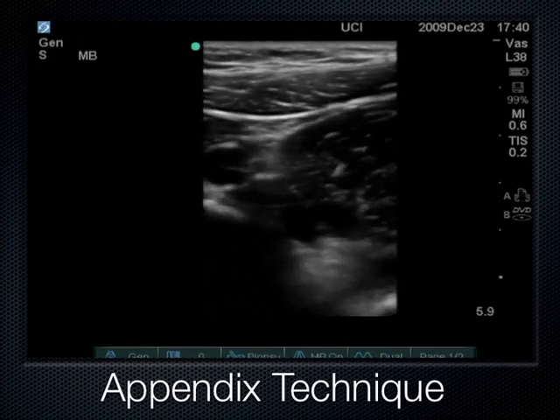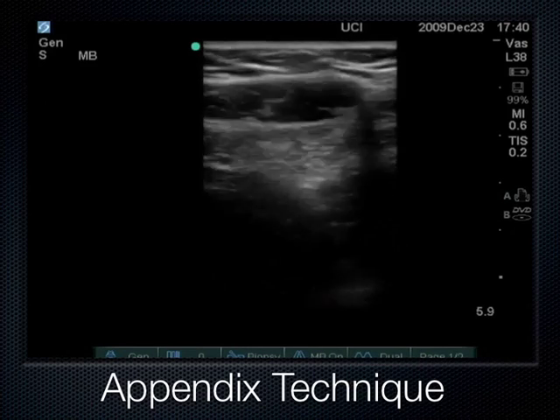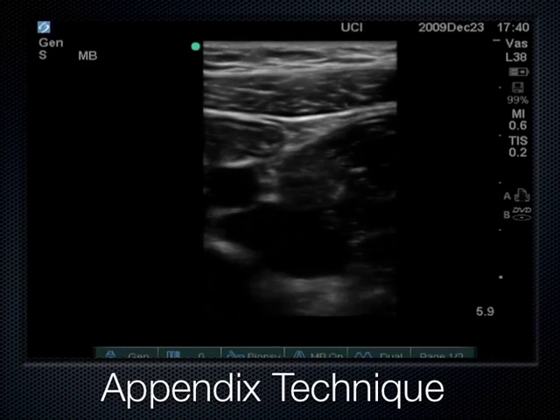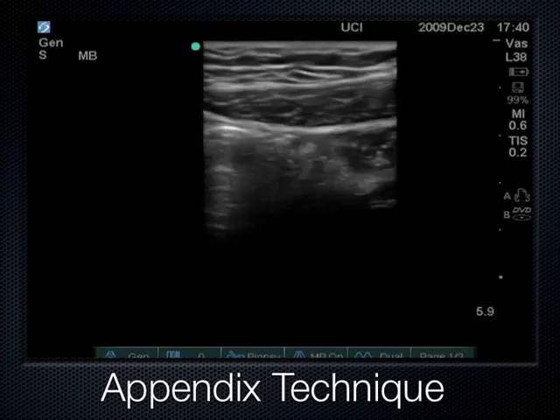So this is kind of what we do. Here's the abdominal wall musculature up here. Here's a loop of bowel right there, okay? This is the iliac vessel right there. And what we're doing is we're pushing really hard. So this muscle right here, this is the psoas muscle. The psoas muscle is actually coming up and coming into contact with the abdominal wall musculature right there. And there are loops of bowel that get sandwiched between the psoas, which is a very long muscle.